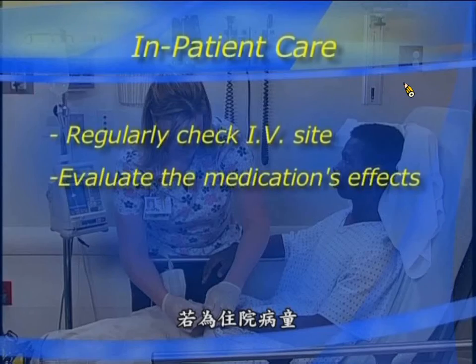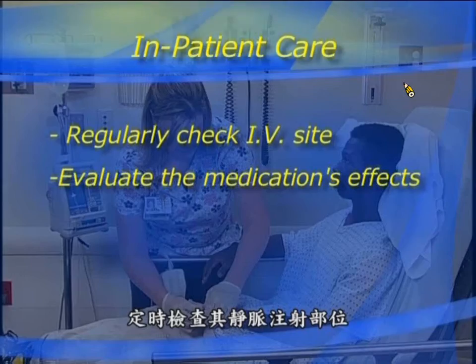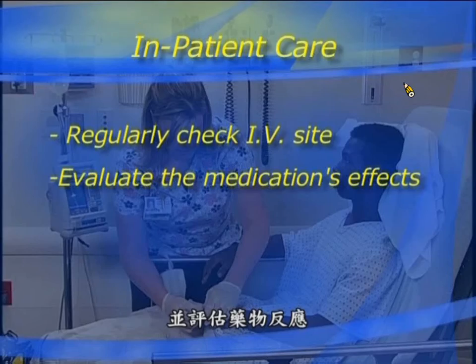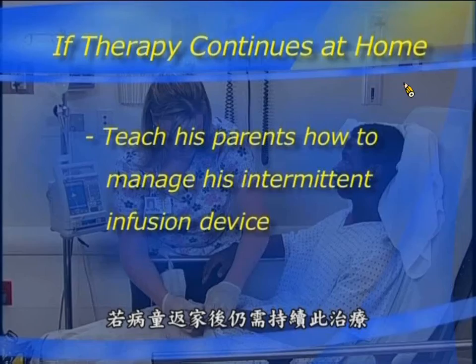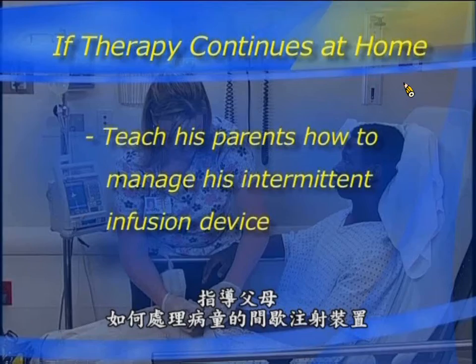While the child is in your care, regularly check his IV site and evaluate the medication's effects. If his therapy will continue at home, teach his parents how to manage his intermittent infusion device.